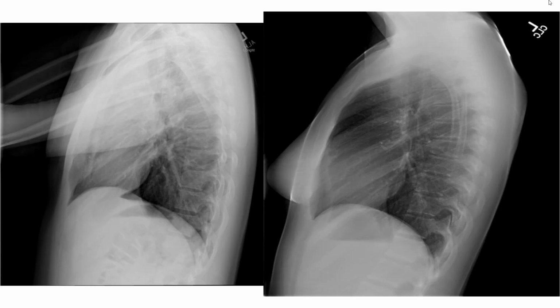All right, so these are some images that show good and bad chest x-rays. You can probably guess which one is not the best, and that would be this guy. His arms are out in front of him, kind of in a genie pose, and his clothing artifacts and arms are overlapping with that retrosternal space. It's not nice and clear anymore. Versus this person whose arms are fully above their head, with a nice clear retrosternal space that we can see.